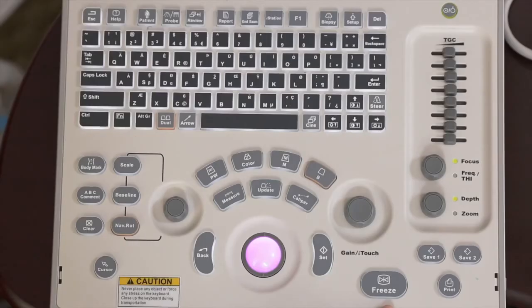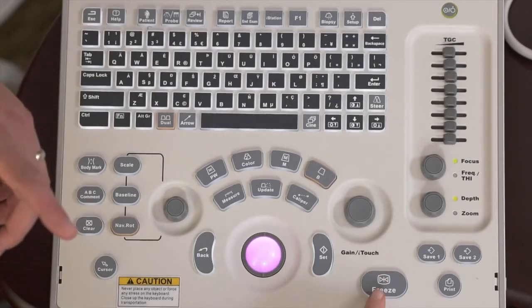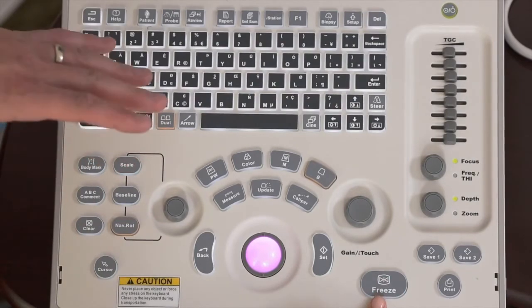And to do the cine loop, you do want to make sure that you are frozen, or else you'll get a little message that says, go ahead and freeze first before you go into cine. Before you hit the cine clip for the Save 2 button.